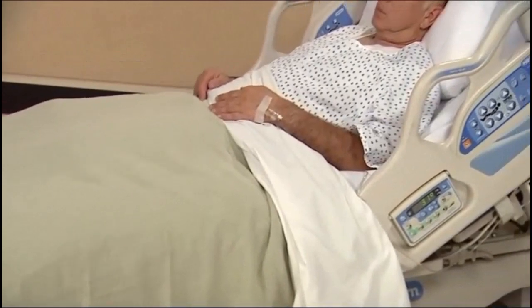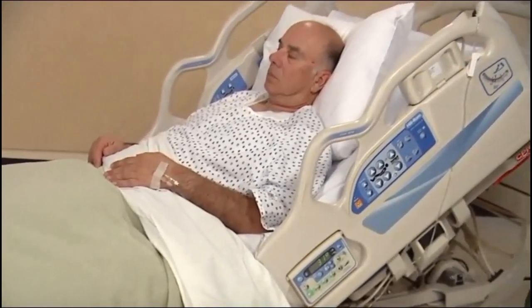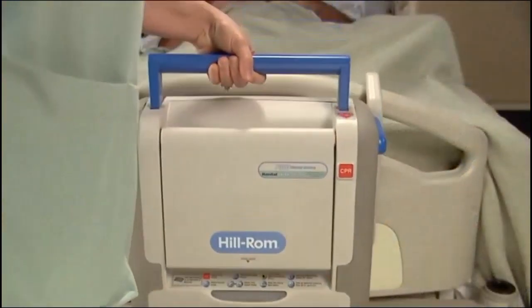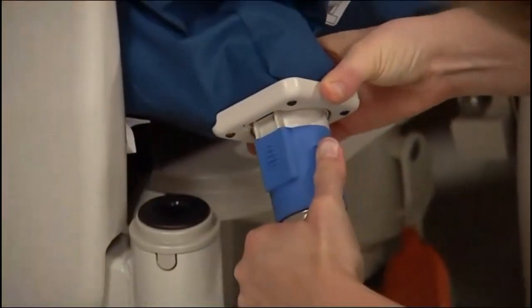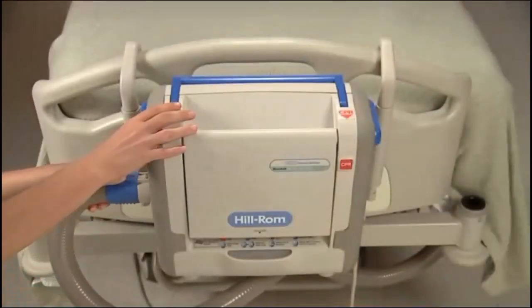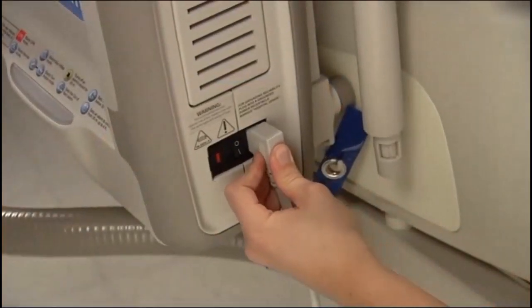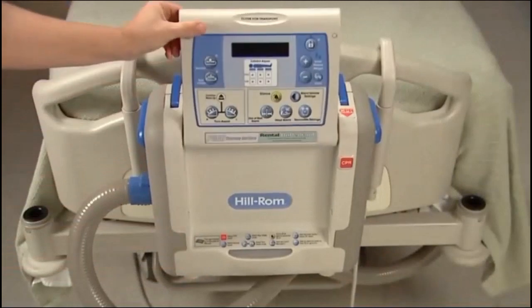Transport the patient on the bed as necessary. When the transport is complete, reinstall the control unit and hose assembly, connecting it to the surface. Then connect the unit to an applicable power source and proceed to set up the system for occupant placement.